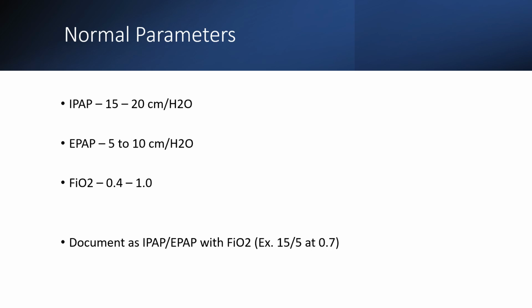Now, one thing to remember, the greater the difference between the pressures, or the greater the pressure support, the more ventilatory assist they're going to get. And then the PEEP or bottom number is going to help contribute to improvement in oxygenation along with the FiO2. And too, your EPAP or your PEEP or your CPAP also helps to balance that pressure differential that can occur with cardiogenic pulmonary edema. So if I'm trying to displace pulmonary edema, the bottom number is going to be more helpful. So I'm going to be quick in my CHF exacerbation, let's say, to up-titrate my EPAP from 5 to 6 to 7 to 10 to try to offset that when I see pulmonary edema.